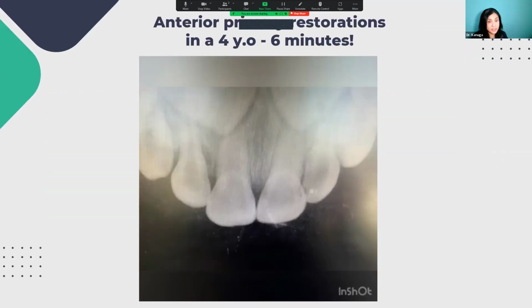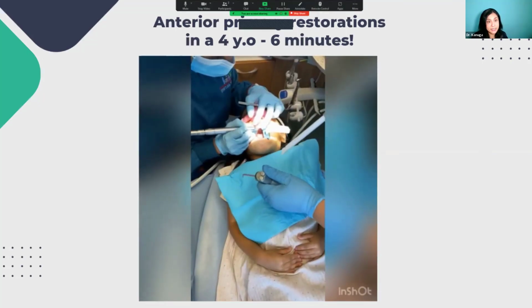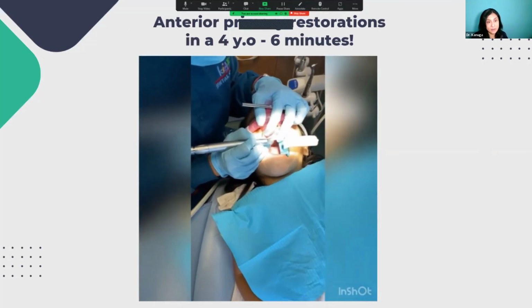This short 3-minute video is of me completing interproximal restorations on number D, E, F, upper primary incisors.